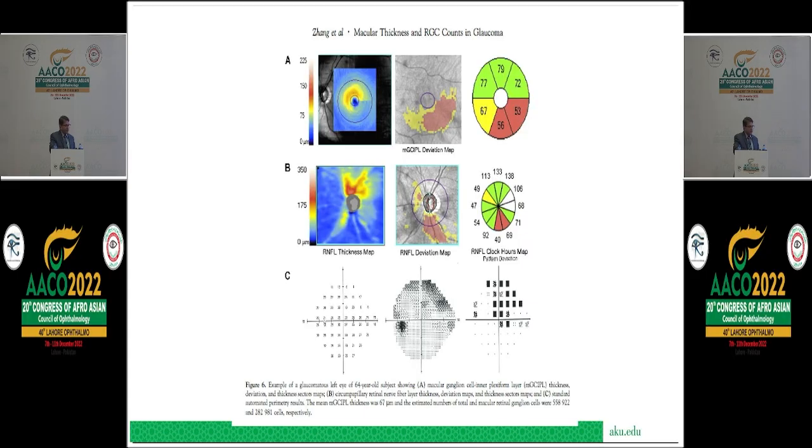Here's an example of an internal confirmation where you see this particular area of thinning in the ganglion cell complex. The machines will have different ways of calculating the ganglion cell layer, with or without the inner plexiform layer. If you have the same machine each time, it's useful, of course, for registration. Otherwise, when people keep switching hospitals or machines, it can be difficult. You can see that there is some loss of nerve fiber arcuate-shaped bundles down below, which is showing in the ganglion cell complex, and this is showing the area of loss.